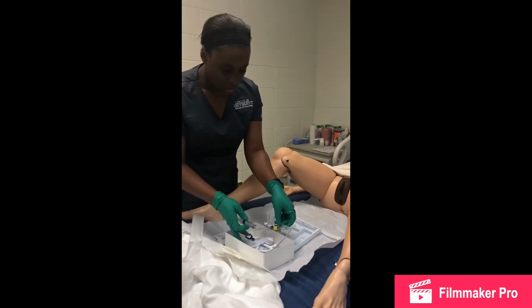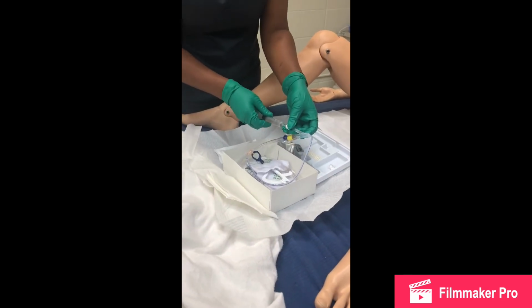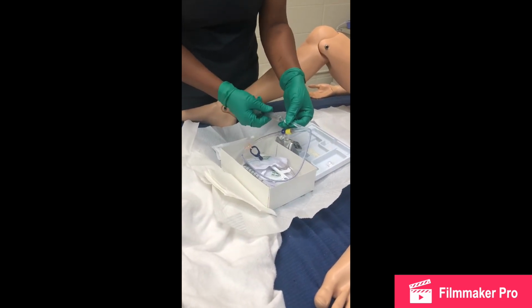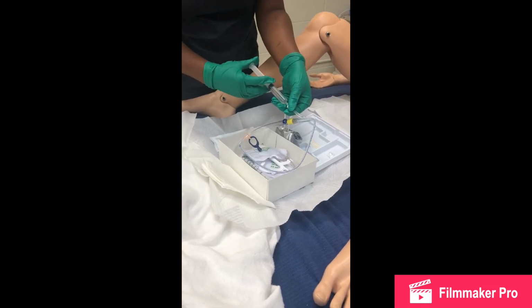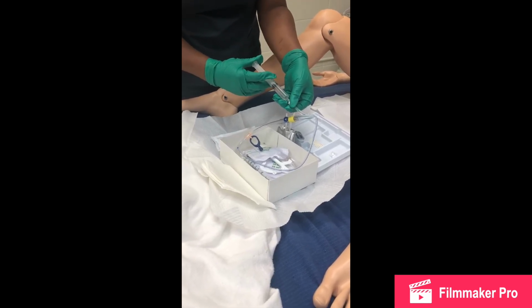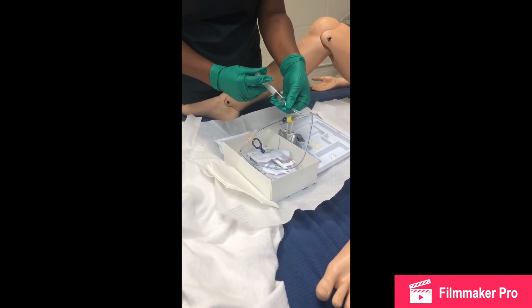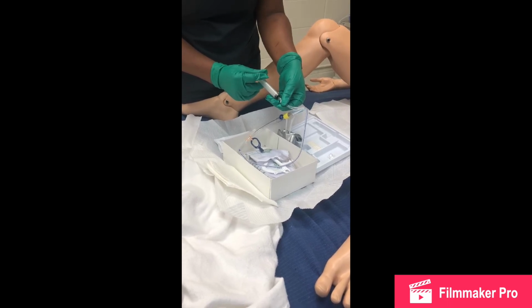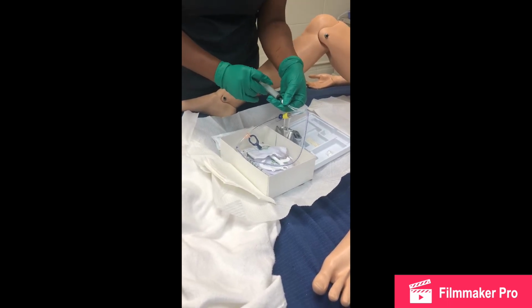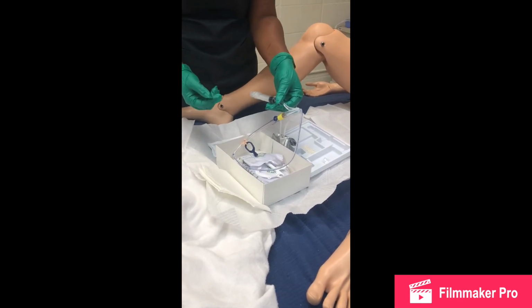So now it's time to test my balloon. My balloon seems to be working, so now I'm going to let gravity pull back the fluid.